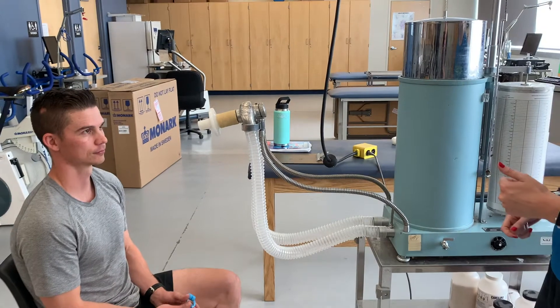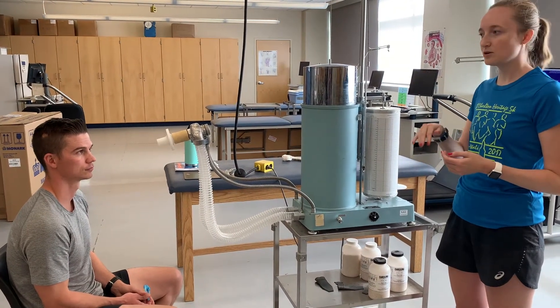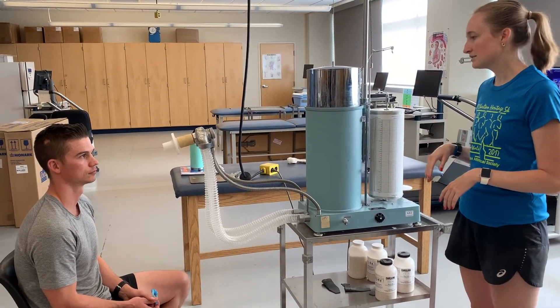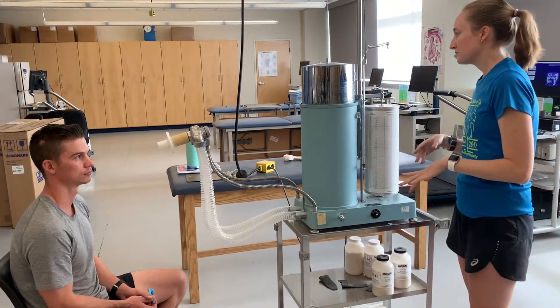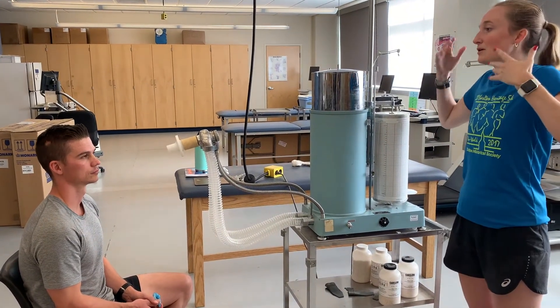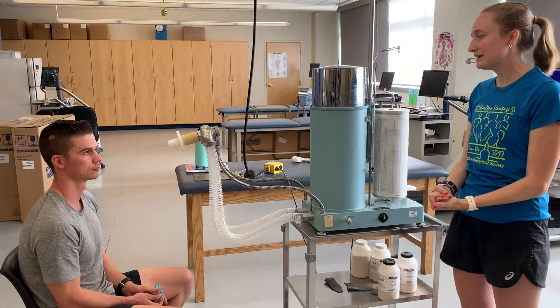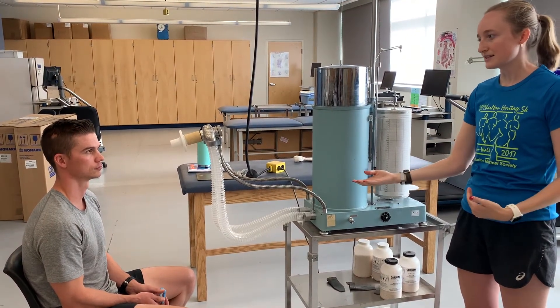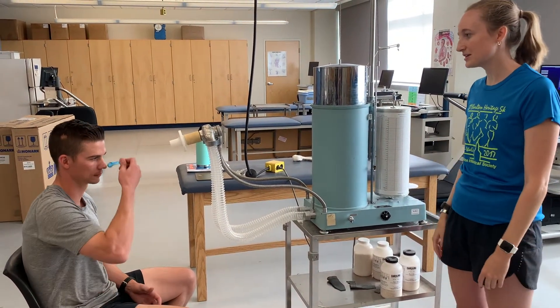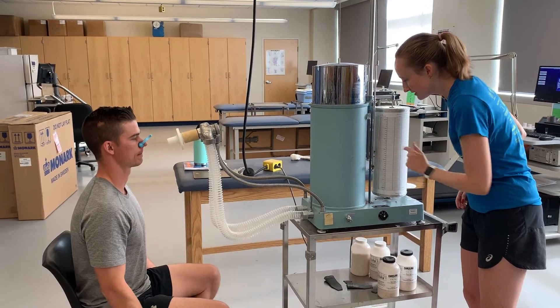Okay Ethan, I'll explain what you're going to be doing. Start with just nice normal breathing — when I let you know, go ahead and put on the mouthpiece and start with some normal inhales and exhales. Whenever you're ready, at the end of a normal expiration, breathe all the way in and fill your lungs all the way to the top. When you can't breathe in anymore, blast that air all the way out as fast and as much as you possibly can, then hold it at the bottom for about six seconds.